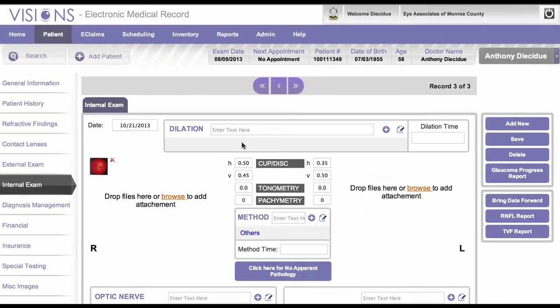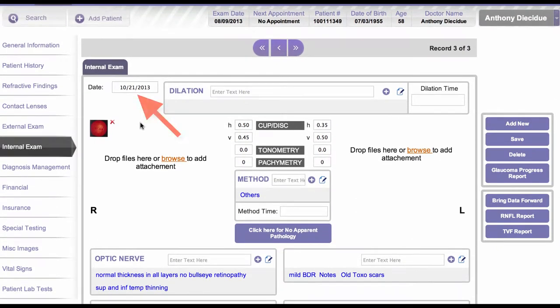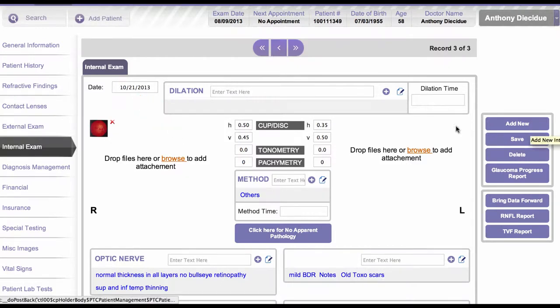Going top to bottom, every time the patient has a fundus examination we will need to put a date in here. When you add a new record it will automatically put in today's date.